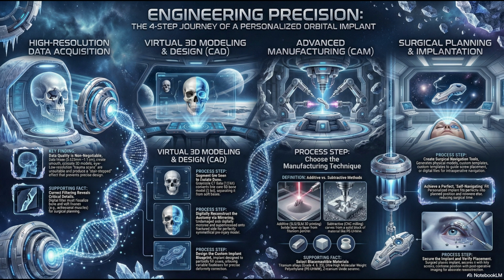Well, the malleability of mesh is a known risk factor. Sure, it is the ultimate test of data integrity. The source material we're looking at shows this critical surgical error. Even a perfectly modeled implant can be seated incorrectly. If the front edge doesn't sit perfectly flush against the orbital rim, when you tighten that fixation screw, the back of the implant can pivot upwards, and that posterior elevation can press directly on the orbital cone or, in the worst-case scenario, the optic nerve.